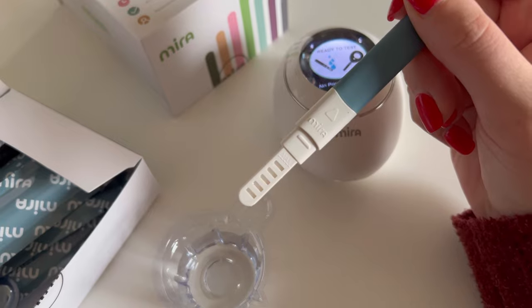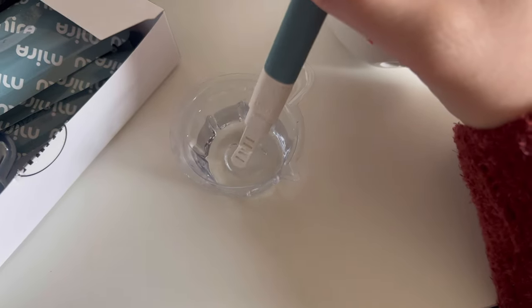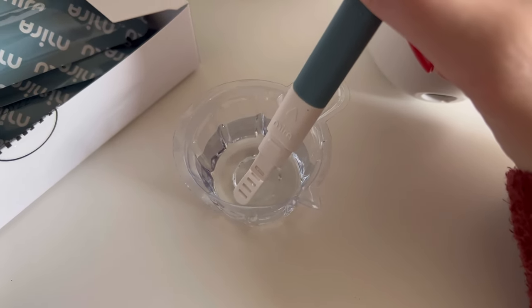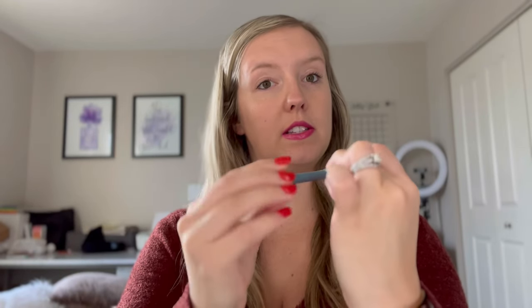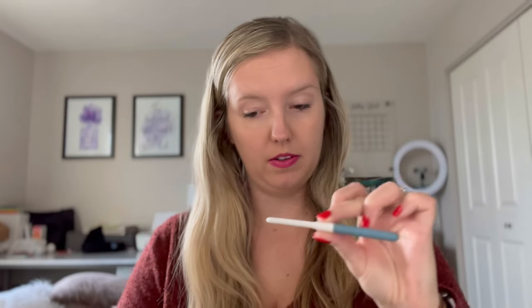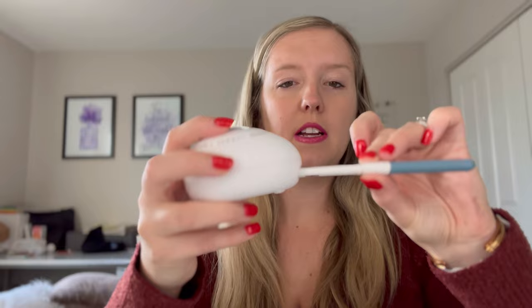As you can see, it's got a little max line, so let's not immerse it beyond that. This is just water to show you as a demonstration, but we'll hold it in here for 10 seconds. Once your test wand has been submerged for 10 seconds, take the blue cap off of that end and cover the end that was submerged in the cup.